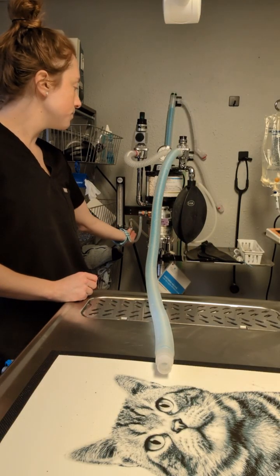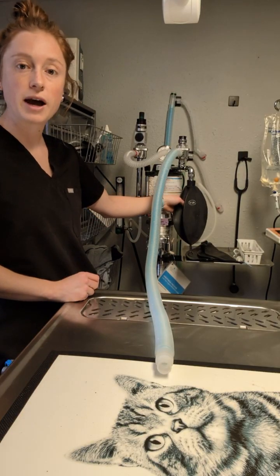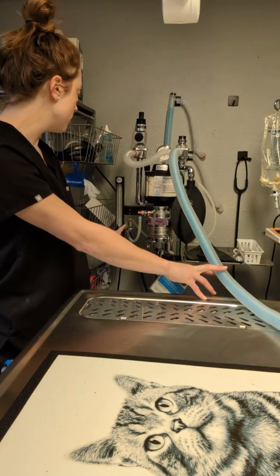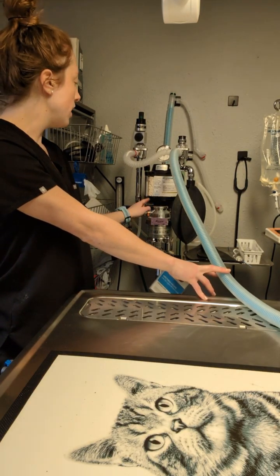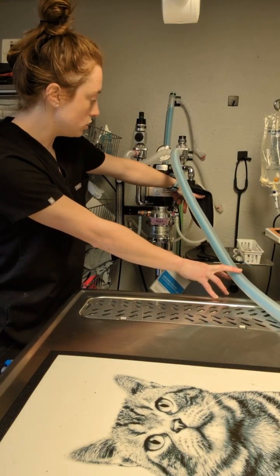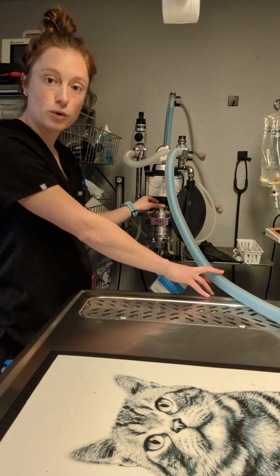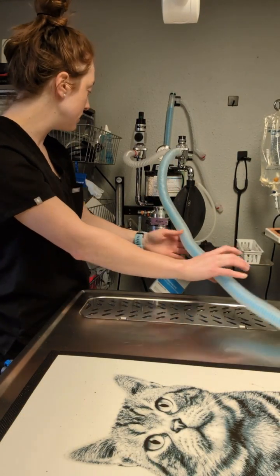So when we push this, you can hear the oxygen flowing through the system, and it will fill our rebreathing bag. Next, we have our anesthetic vaporizer. We use isoflurane mainly, and the oxygen will go from the flow meter and then flow into the import, where it gets mixed with the isoflurane gas, and then it will go to the outlet port here. We just turn the knob at the top to adjust the amount of isoflurane depending on the size of the patient and how deep we want them anesthetized.